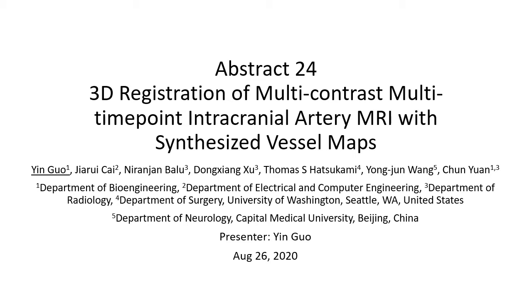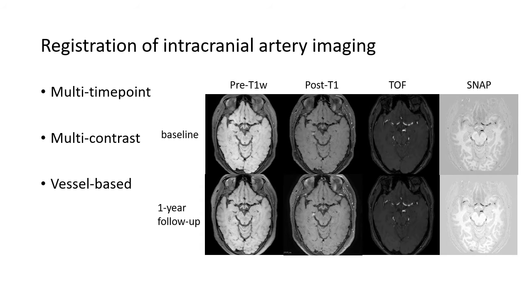Today I'm going to present Abstract 24, 3D registration of multi-contrast, multi-timepoint intracranial artery MRI with synthesized vessel maps. Image registration for MRI scans of different time points and different modalities is a fundamental step for clinical application.